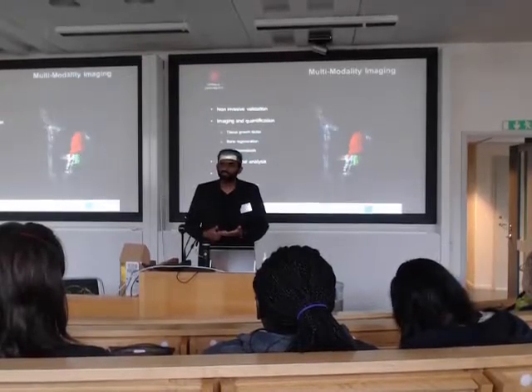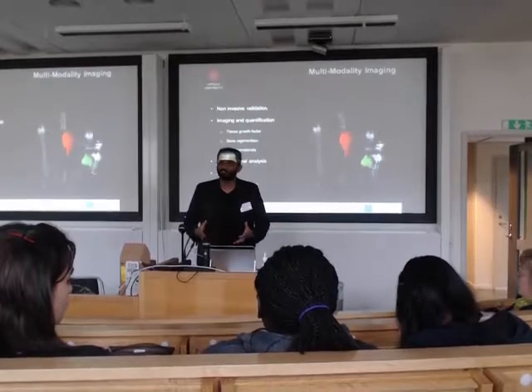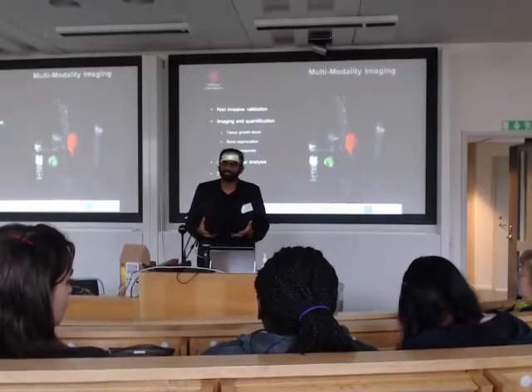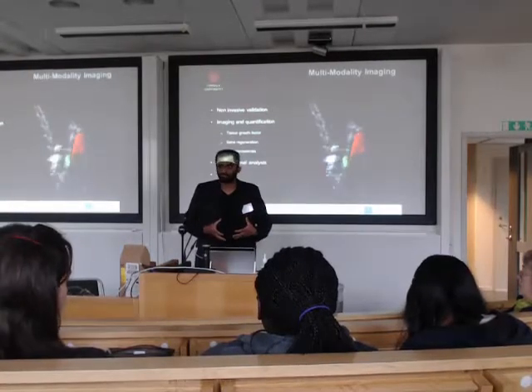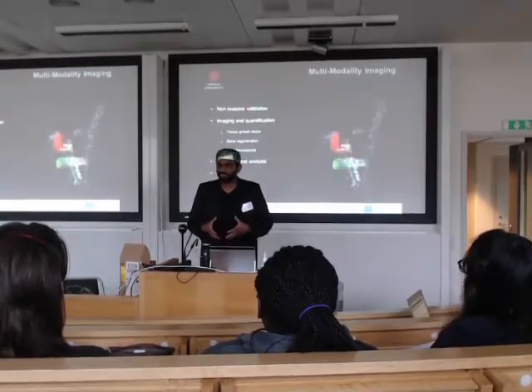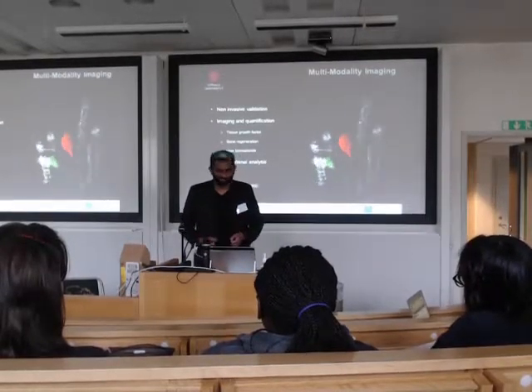Earlier, such studies used to be done as biodistribution studies, so you had to have lots of animals. Per group, you should have at least 20 animals to have such validations. And we just reduced the number of animals to 4. We have published this data as well. So I'm not just making up any stories. This is published data.